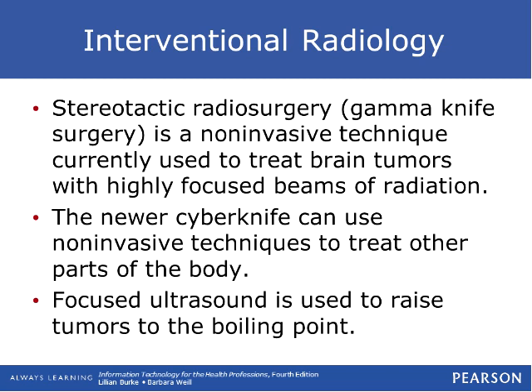And each of those beams is a very low level of radiation, which doesn't hurt any tissue whatsoever. But when all those beams are concentrated on one site in the brain, they are able to create enough radiation to kill the tumor that's located there. That's what stereotactic radiosurgery is. The newer CyberKnife can be used in non-invasive techniques to treat other parts of the body. So this technique can be used in other parts of the body.